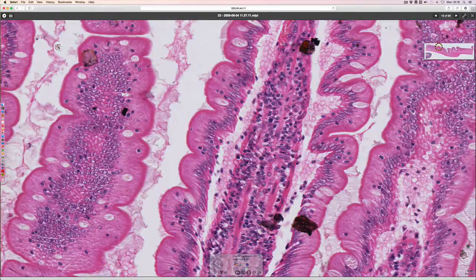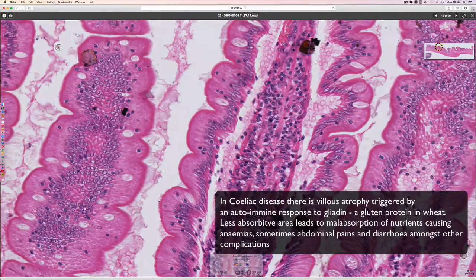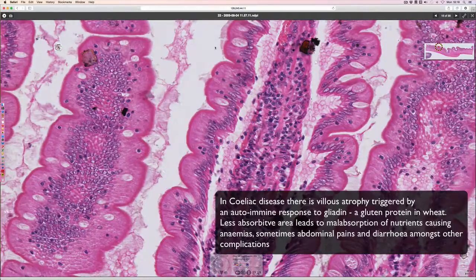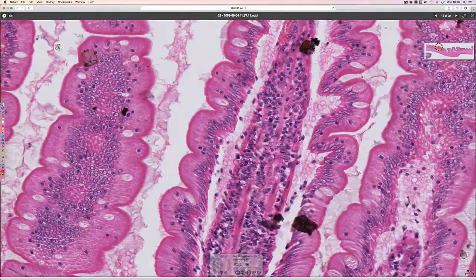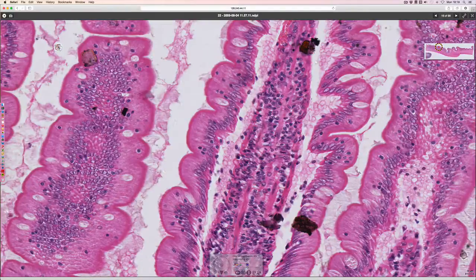Both the ultrastructural surface features — the microvilli on the surface of these tall columnar cells, which are called enterocytes — and the larger finger-like projections of the mucosa making up the villi together increase the surface area of the small intestine for absorption, maximising contact of the food with the cells as it passes through.